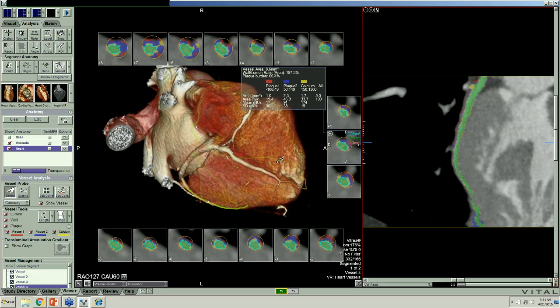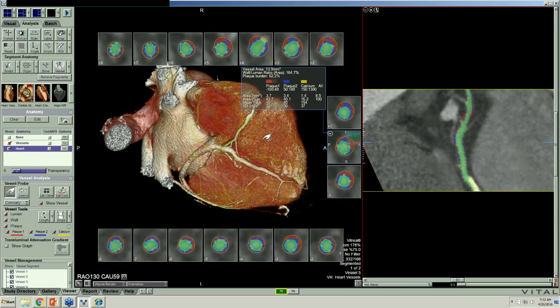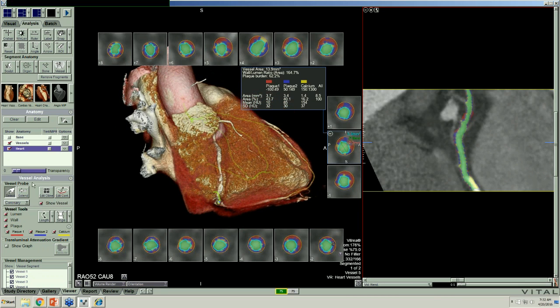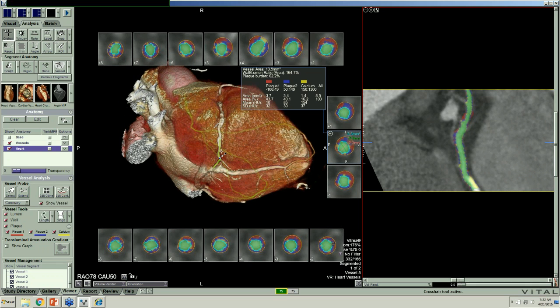Right looks like a pretty big vessel. This is a vein going along here. That's the interventricular sulcus. And so here we're going to click on here and see if we can get the right up. And here comes the right a little bit. We can make it come along here by guiding it. I'll get my pencil and move up here, and we'll guide the right.